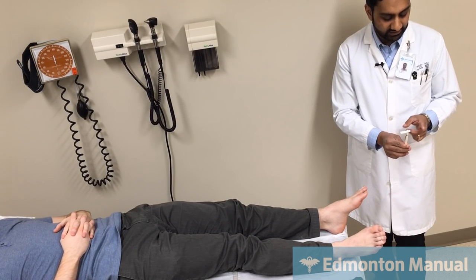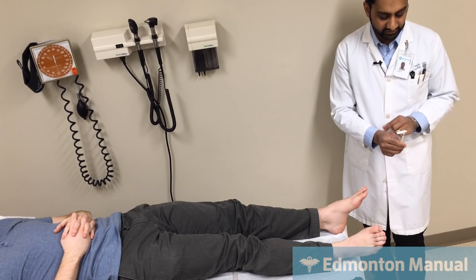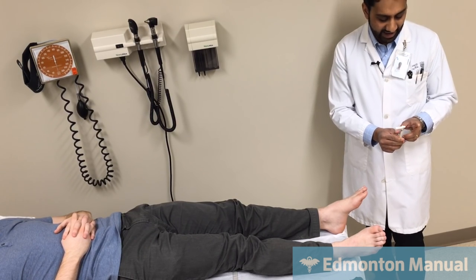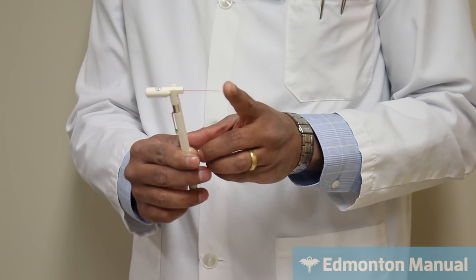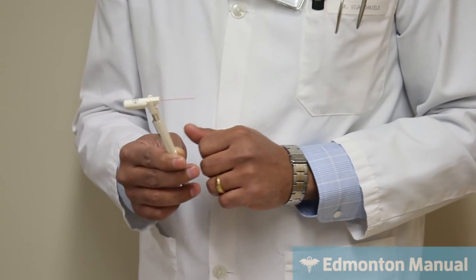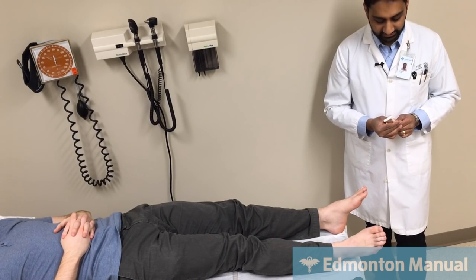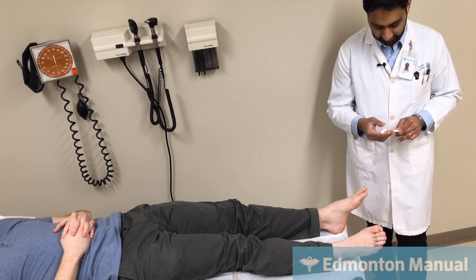You have to be careful. You don't want to overbend it, or else you can actually lose its ability to test properly, but it has to bend a little bit. Like, if just a tiny bit is not enough, it really needs to bend, okay? So that, again, just takes a lot of practice and just knowing where to test. And that ends the testing for the monofilament.